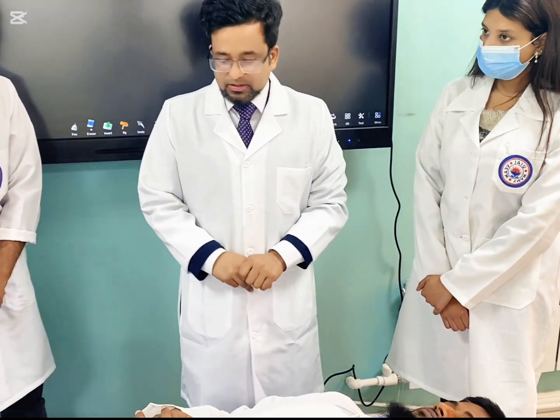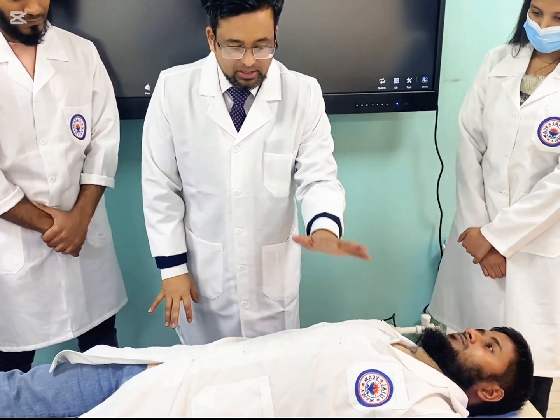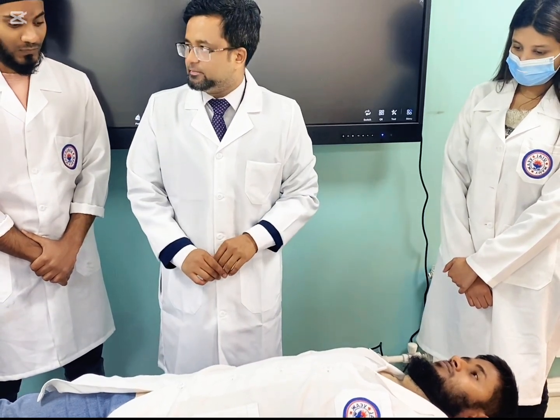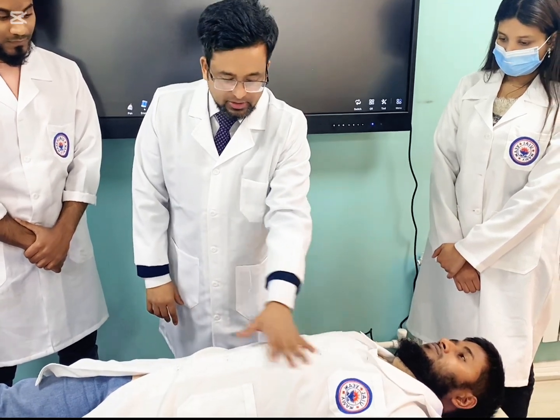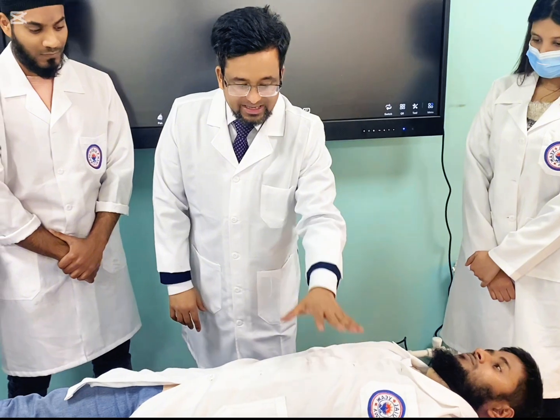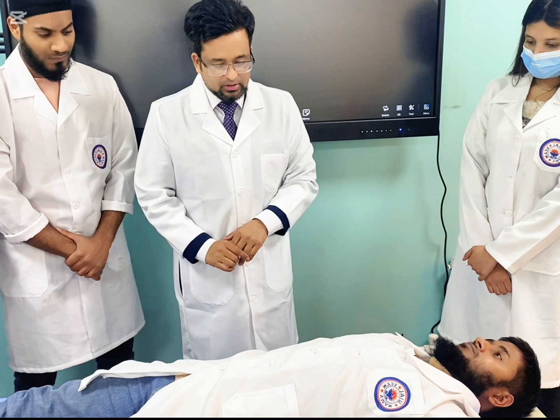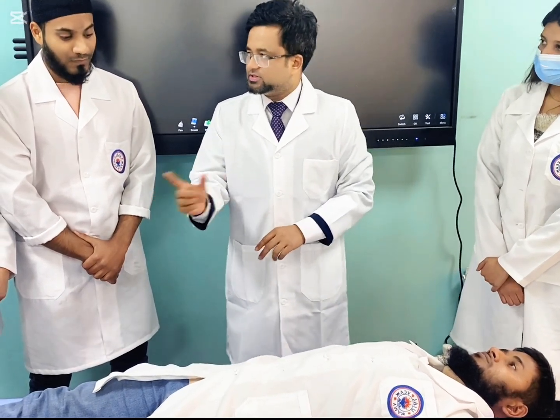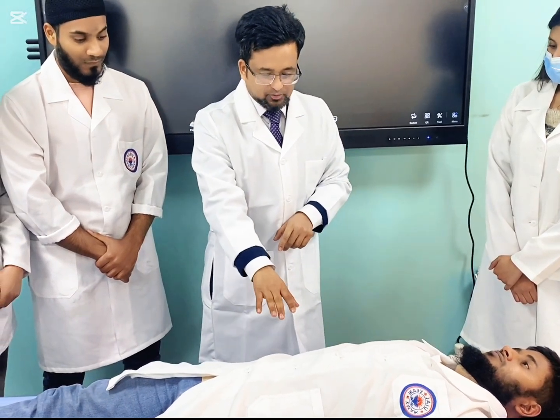Then respiratory rate. For respiratory rate, the patient should be properly exposed to check his respiratory rate, to see his chest expansion. It is very important. He's well clothed here. So for your patient, you need to expose him properly so that you can see his chest movement. You can count his respiratory rate by standing here. Respiration is equal to one inspiration and one expiration.